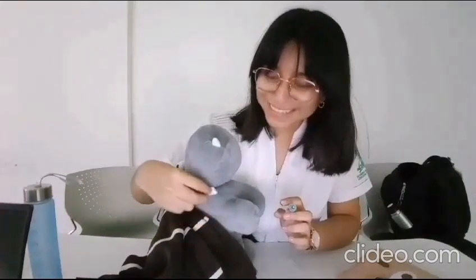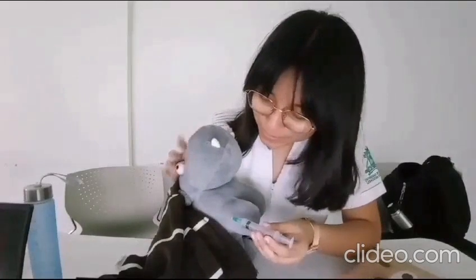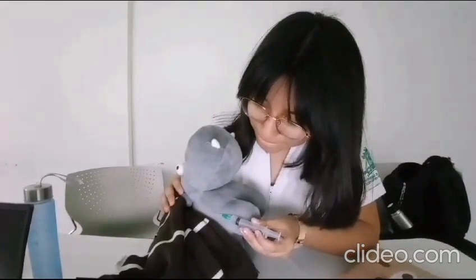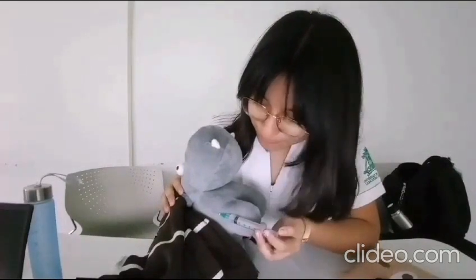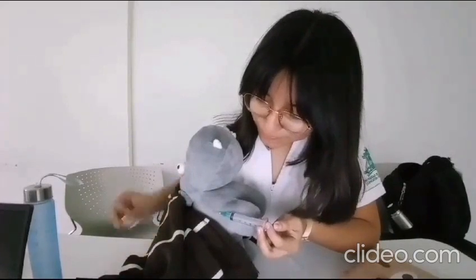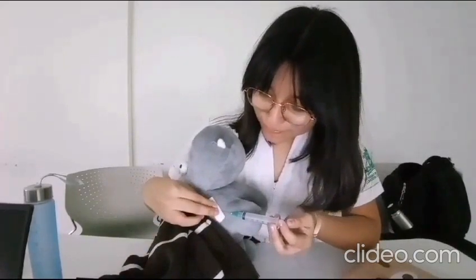Load your medication and change the needle. Identify, select, and perform cleaning with a swab. Remember to extract the air from the syringe, delimit and introduce the tip of the needle with the bevel upwards at an angle of 15 degrees in the corresponding place. Slowly introduce the medicine and verify that a bubble is created with the same medicine, and remove the sharp. Finally, give the necessary recommendations.